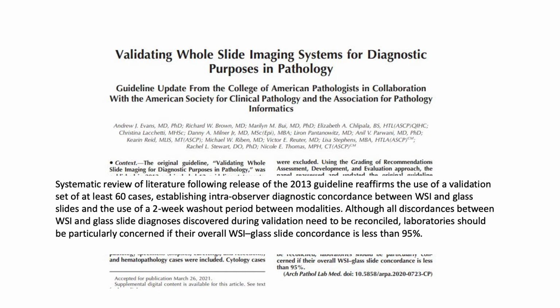In conclusion, it highlights that the systematic review of literature following release of the 2013 guidelines reaffirms the use of a validation set of at least 60 cases, establishing intra-observer diagnostic concordance between WSI and glass slides, and the use of a 2-week washout period between modalities. Although all discordances between WSI and glass slide diagnosis discovered during validation need to be reconciled, laboratories should be particularly concerned if their overall WSI glass slide concordance is less than 95%.